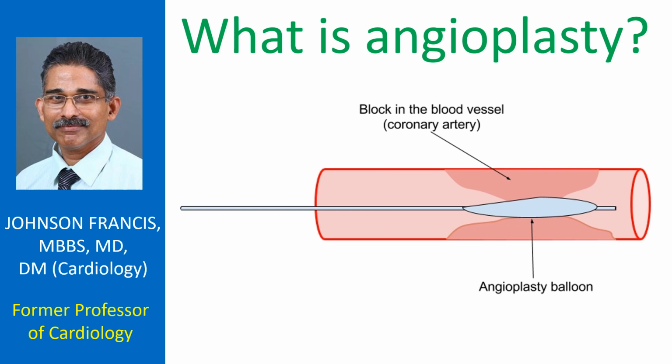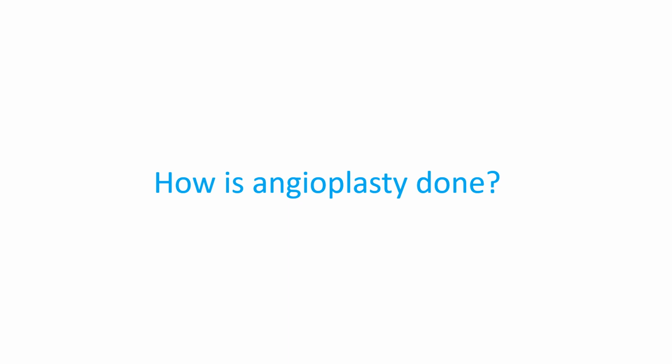Angioplasty is, in simple terms, the removal of a block in a blood vessel. The most familiar form of angioplasty is coronary angioplasty, removal of blocks in the blood vessels of the heart. Angioplasty is done using small tubes with balloons attached at the tip, known as balloon catheters.